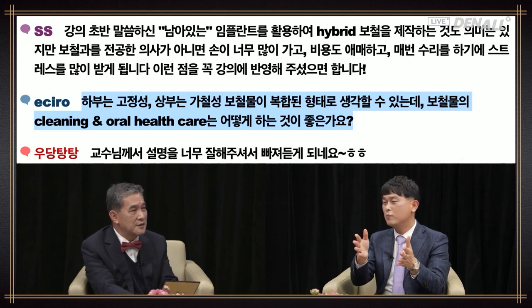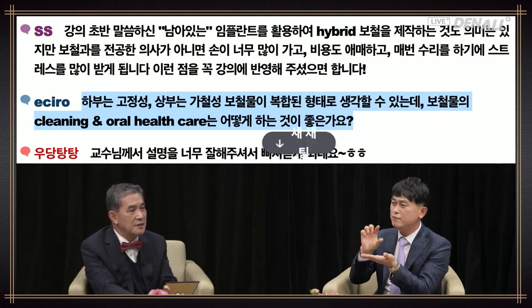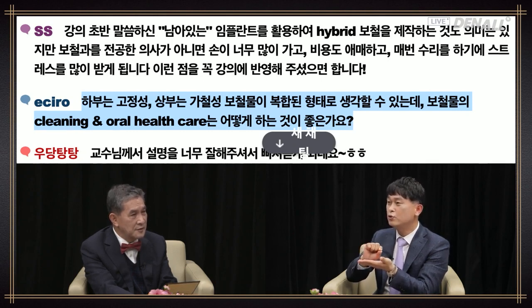As I mentioned during the lecture, there should be 1.5 to 2 millimeter space between the gingiva and the bar. It is a milled bar, so you can insert an interdental brush into the space and the patient holds a mirror, and I instruct the patient to clean under the bar. If the patient is not skillful at that, I don't send the patient home.